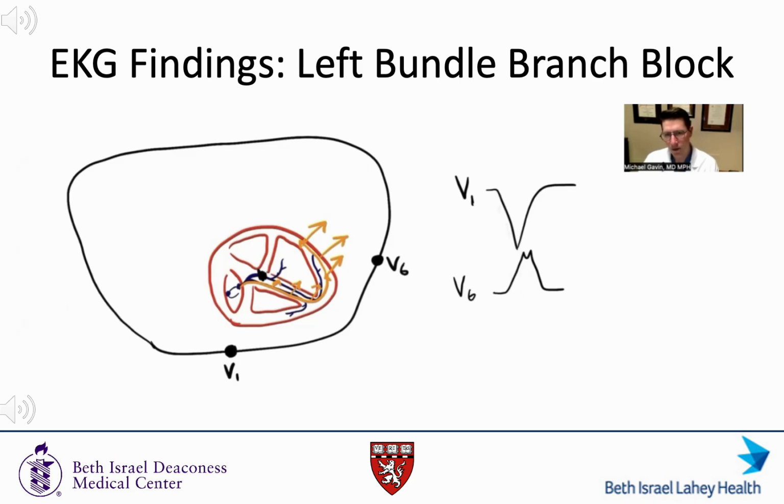And that's why when you look at trying to determine VT versus not VT, this RS duration is relevant. The longer the RS duration is, the more likely it is to be VT, because you're now activating through muscle the whole time. So again, the drawing is a little exaggerated.